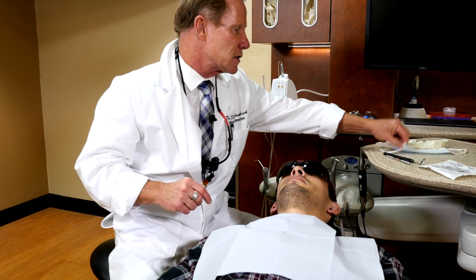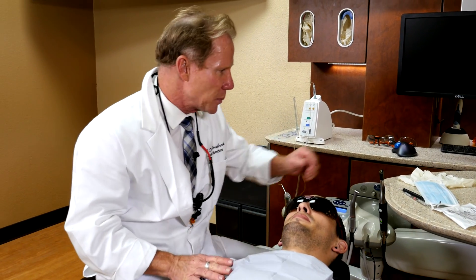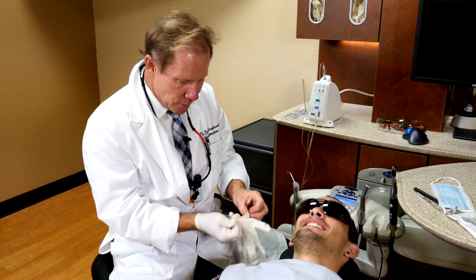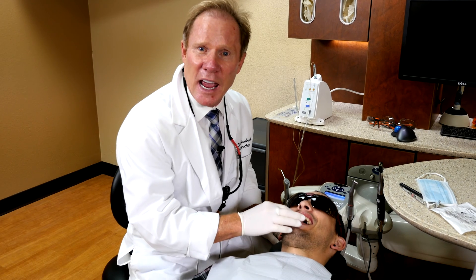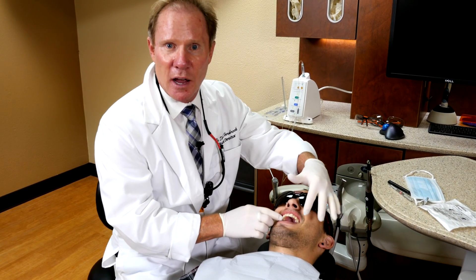So let's look at this. This is Jake — do you mind if I don't wear a mask just for video purposes? Normally I put a mask on. We're going to do a single central on Jake, and the first injection I'm going to show you is what we call an AMSA — Anterior Middle Superior Alveolar.